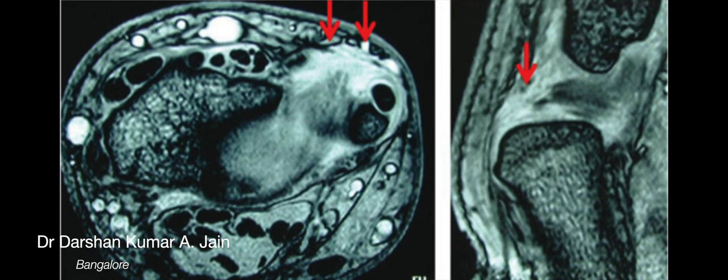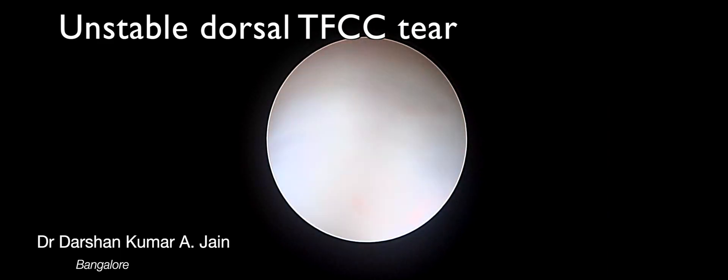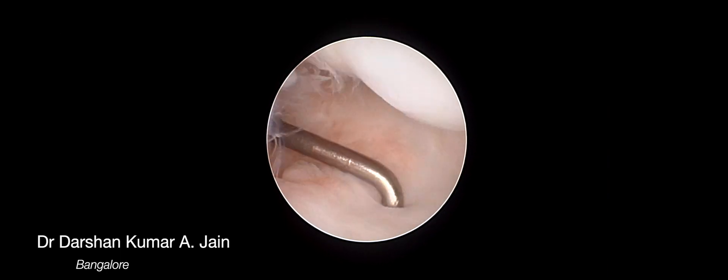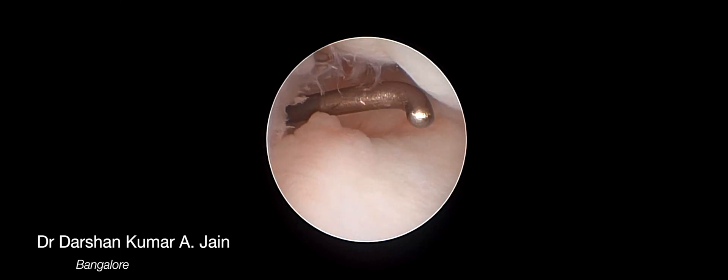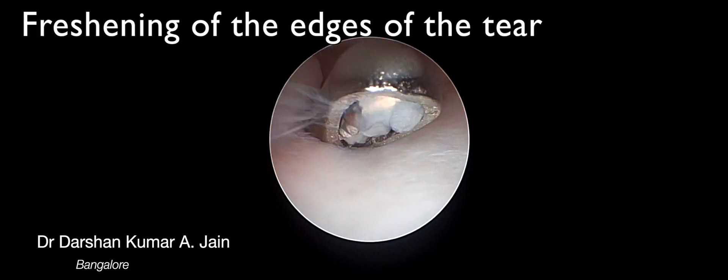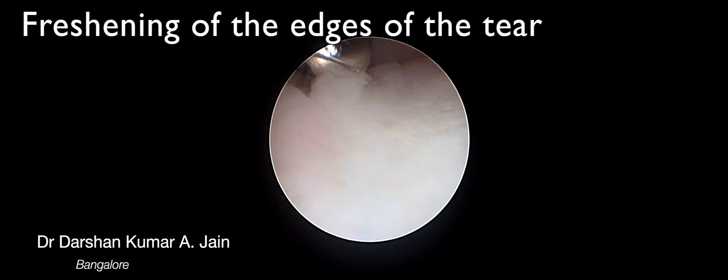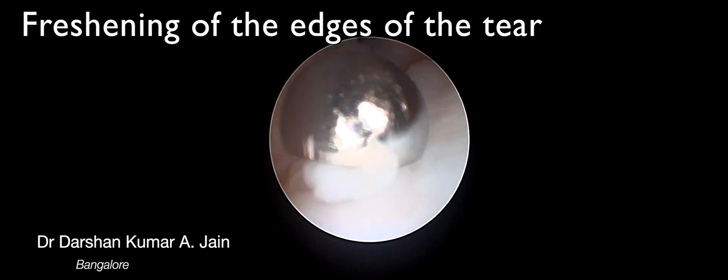This is an example of a dorsal capsular tear in which MRI is done and confirmed, and wrist arthroscopy is done which shows a floppy unstable TFCC confirmed by probing. The repair is begun initially by freshening the edges of the tear so that good healing can be achieved.